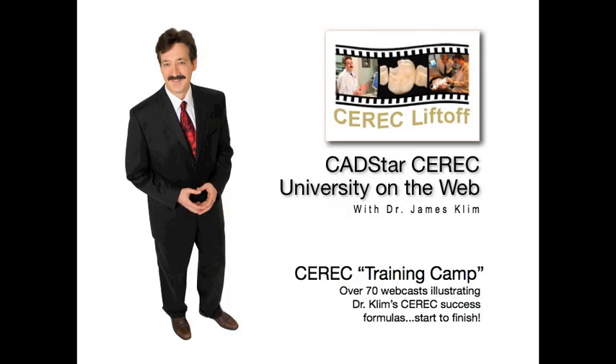You will find in CEREC Liftoff, which is our CADStar University online, that we go through this very thoroughly so you have a good understanding of it. But I just want to alert you that there is a difference.